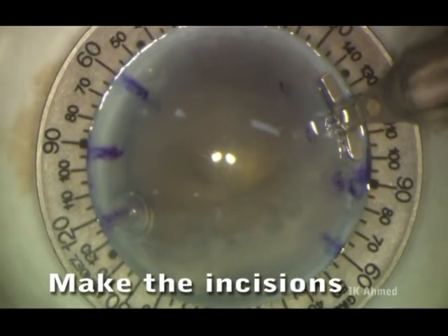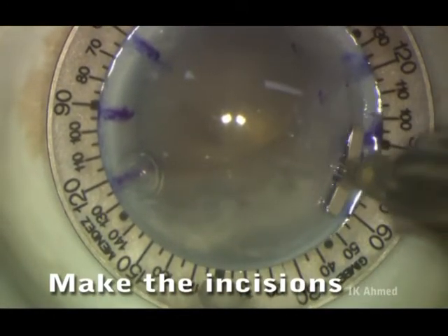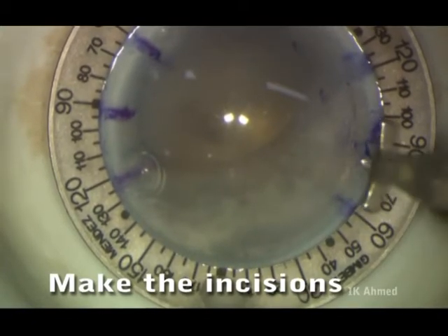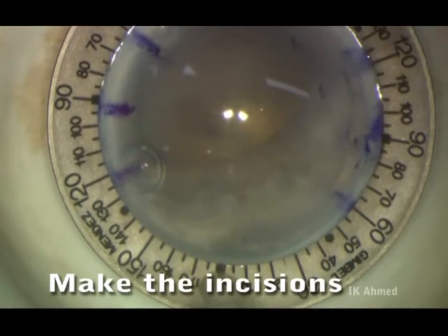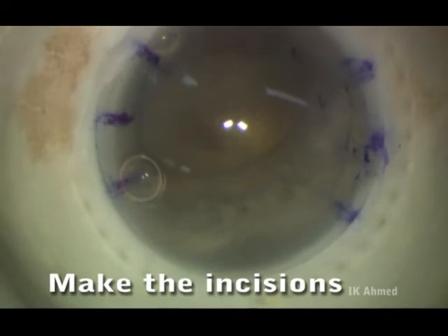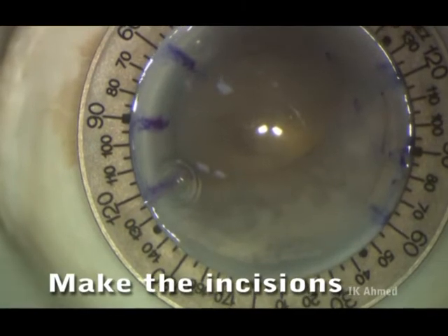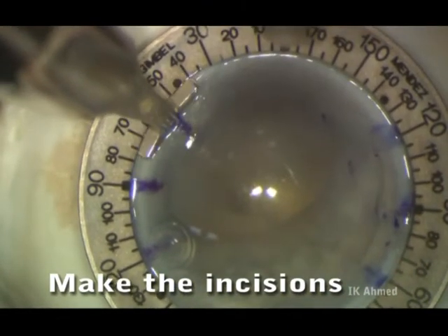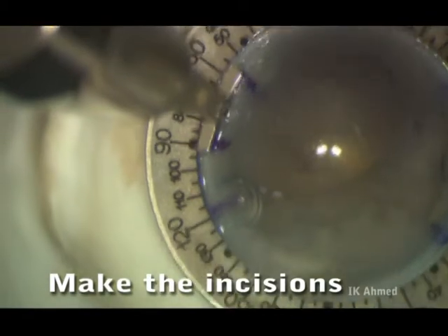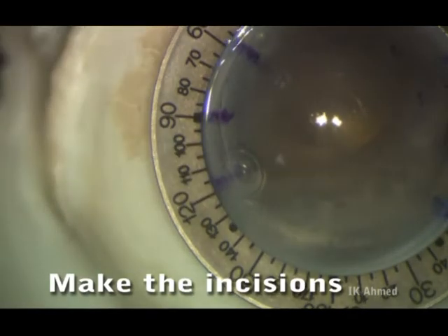Next, a diamond blade is used to create the limbal relaxing incisions following the outline of the ring. Here are the completed limbal relaxing incisions.